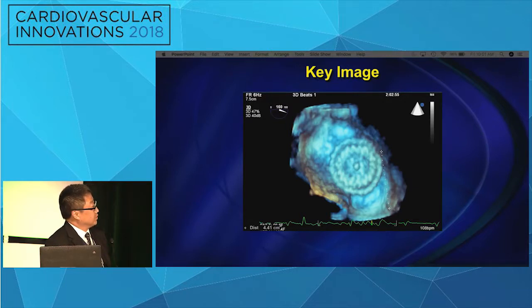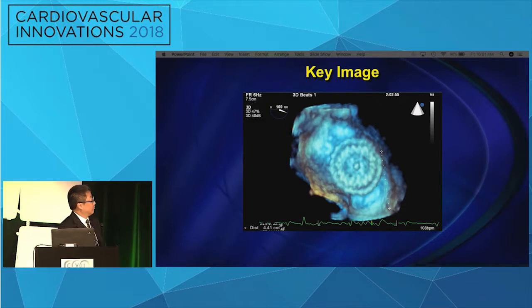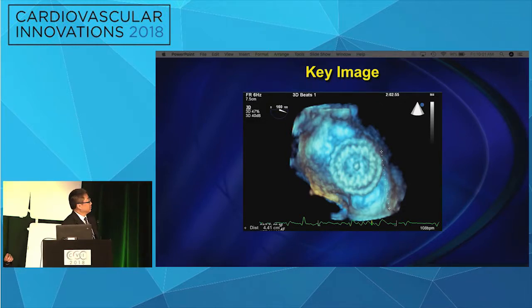In routine cases too, because it really tells you where you cross in relation to the mitral valve, and it can warn you if you're too anterior and you're going to end up with an aorta hugger. But in this case, it was helpful. We know we didn't have room in the ideal location posteriorly. So now your options are to go very low or to go very high. This is about 4.5 centimeters right here. So you'd be very high, or you could go super anterior and try to battle an aorta hugger.